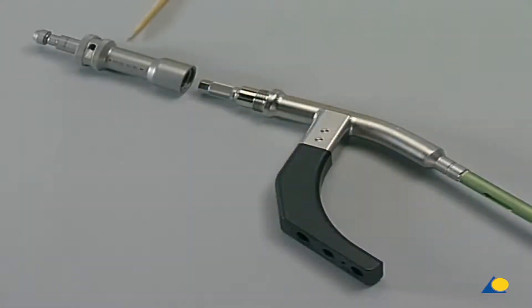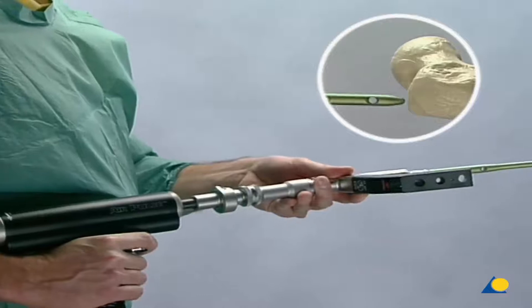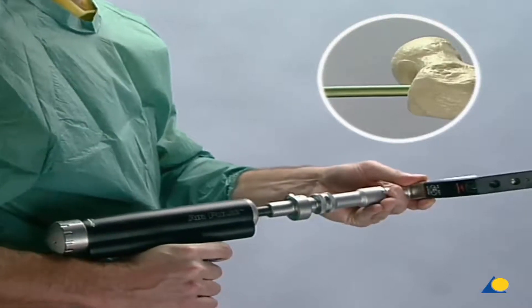The special driving cap is used to connect the air pulse to the insertion handle taken from the UFN instrument set. The UFN is then slowly advanced into the medullary canal with the air pulse.